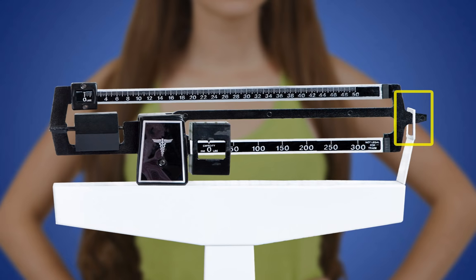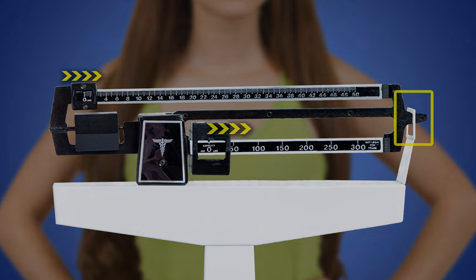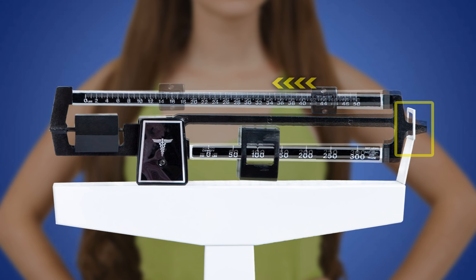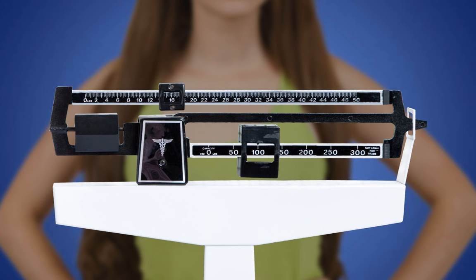If the balance bar is touching the top of the window, you need to increase the amount of weight on the scale. If the balance bar is touching the bottom, you need to decrease the amount of weight on the scale. Remember, the goal is for the balance bar to float in the center of the balance window.